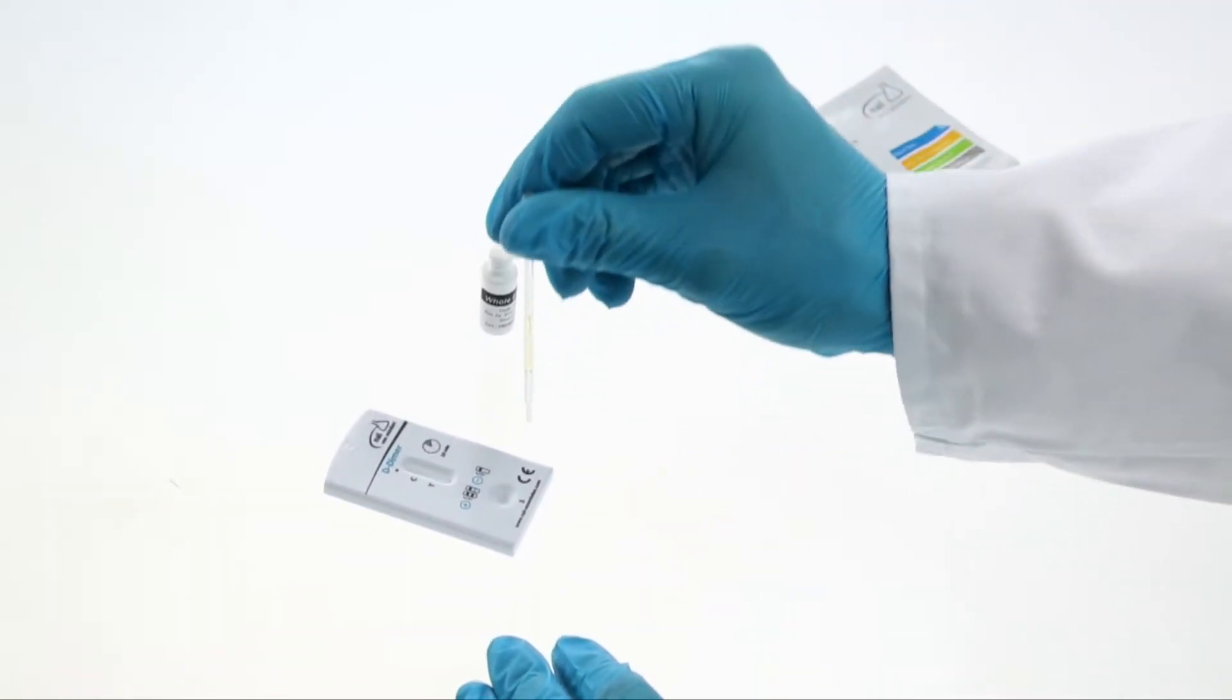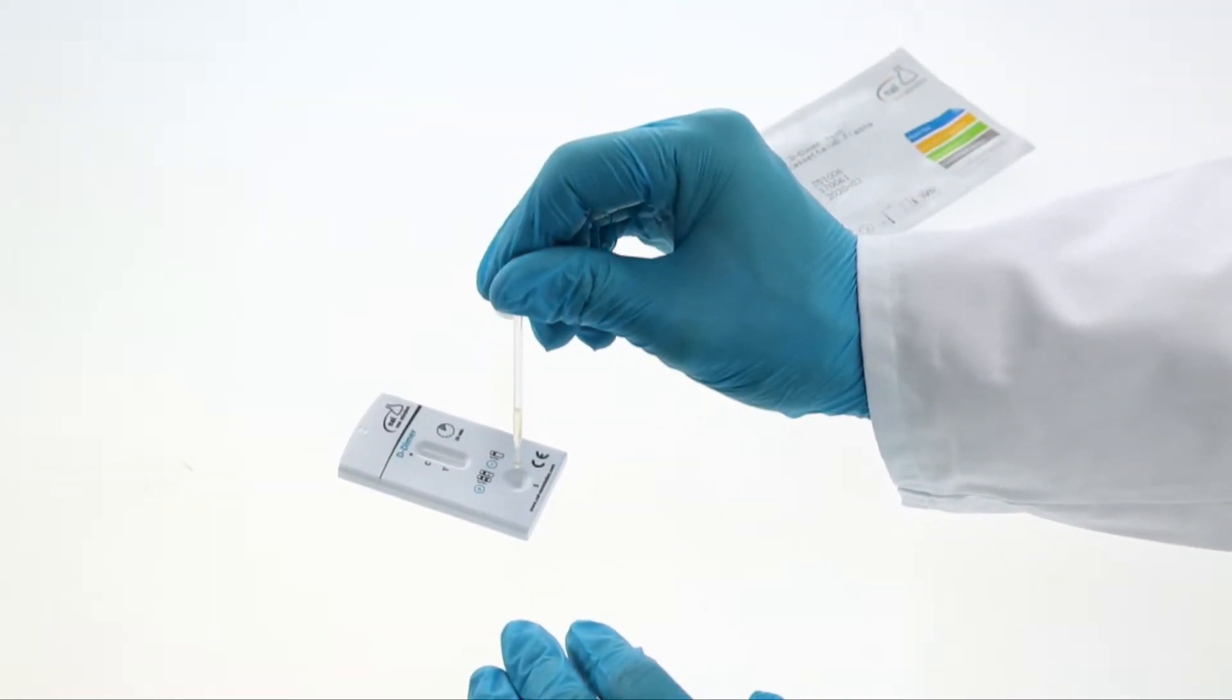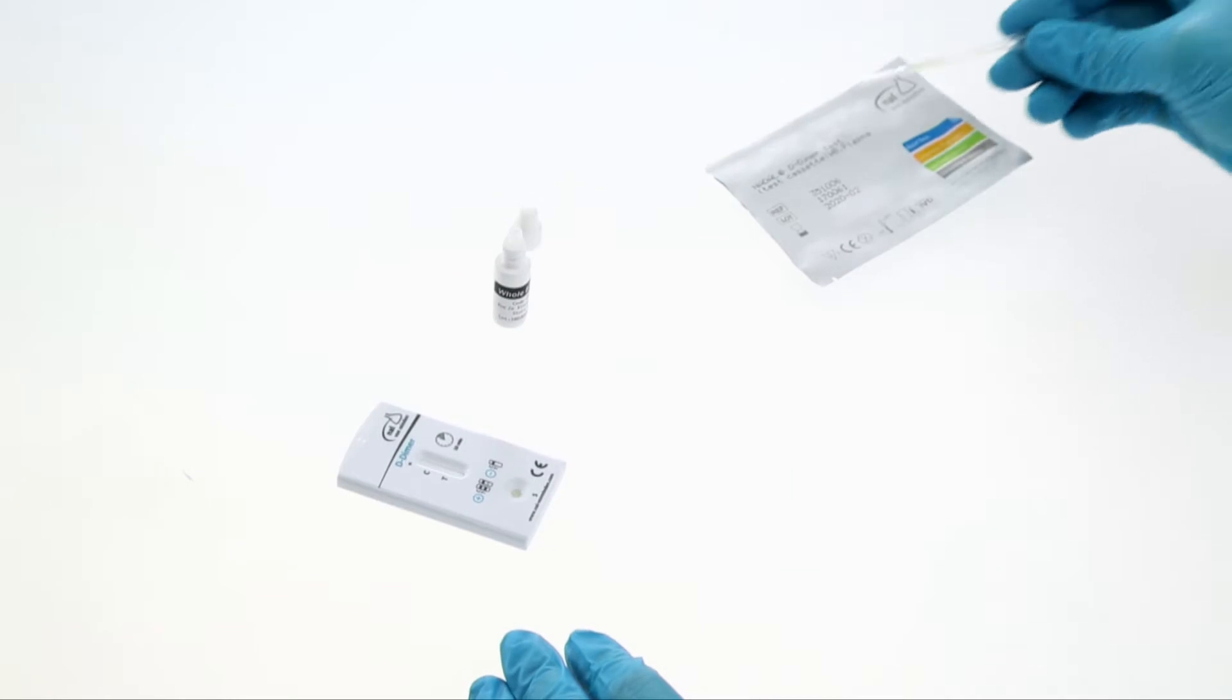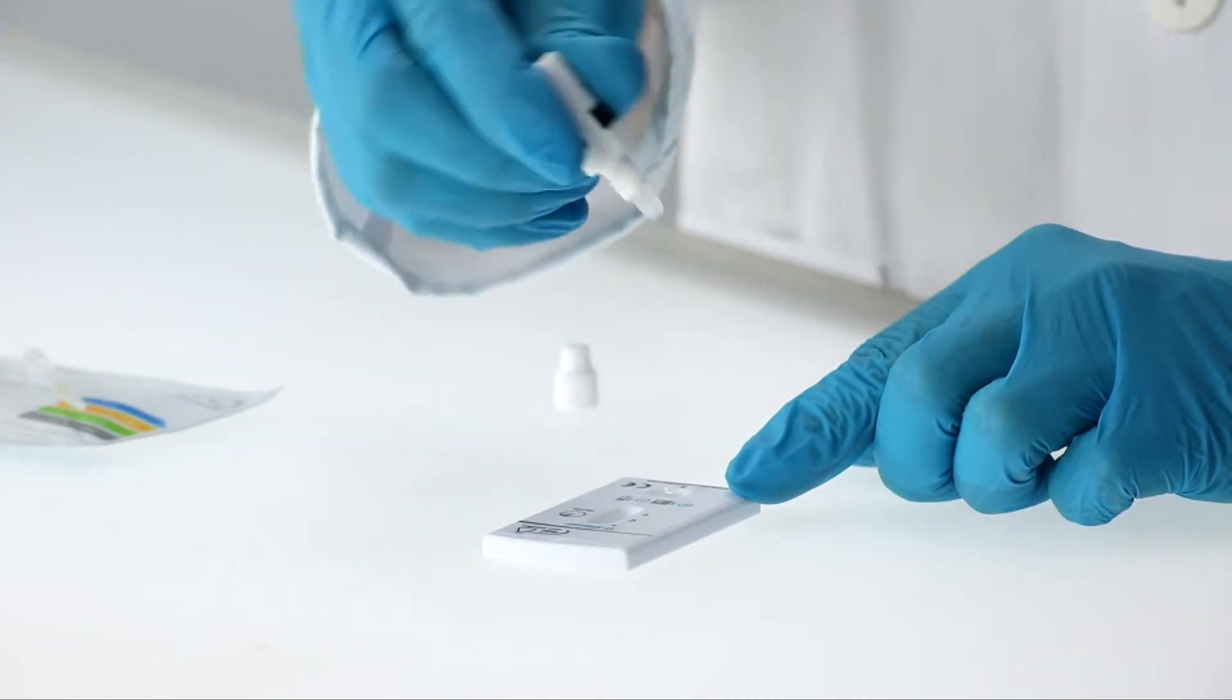Holding the pipette provided vertically, dispense one drop of plasma to the sample well of the test cassette. Then add one drop of buffer.